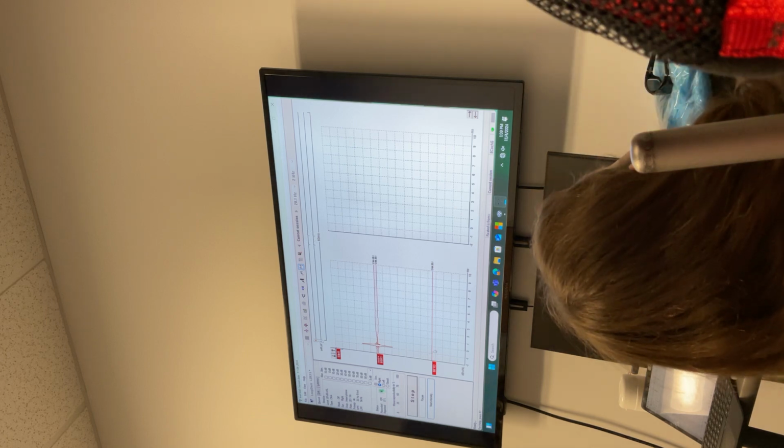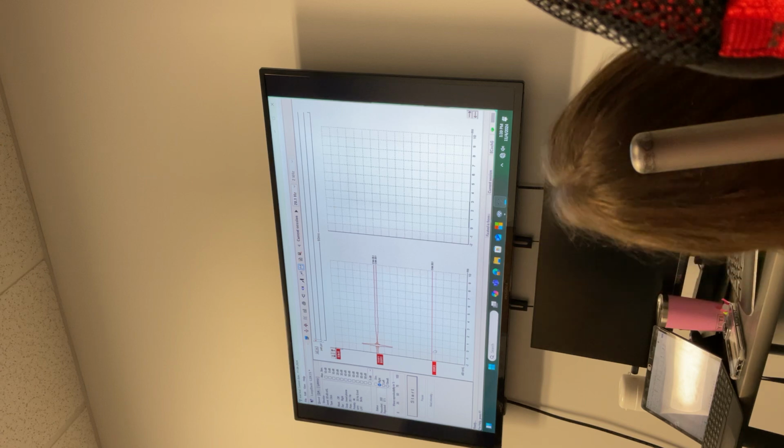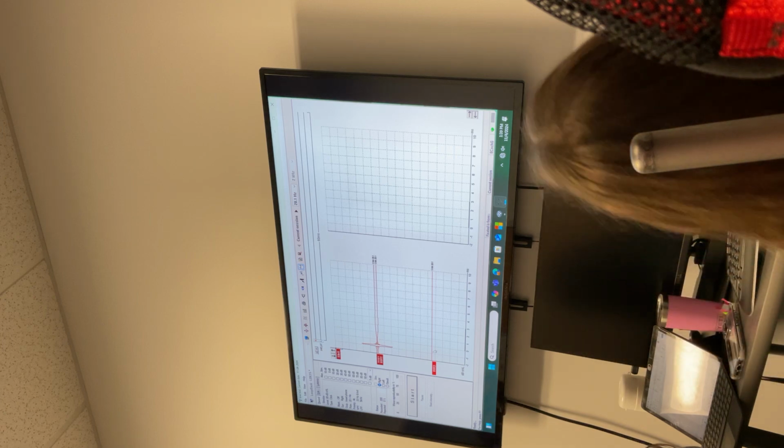So why would you want to do this? ANSD? Why are we doing this? You will not be doing this. No, but why are you showing this to us? Just to get familiarized with the stimulus, like how it's supposed to look?